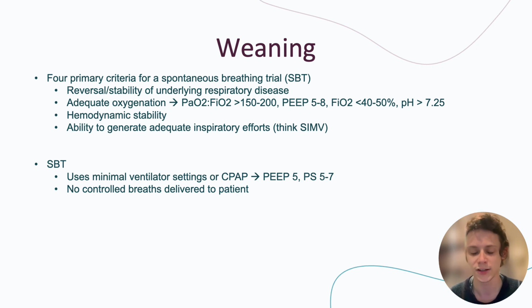Typically, spontaneous breathing trials are done once a day or so, a couple times a day. They can be 30 minutes to a couple hours. Typically, they'll start off at 30 minutes and then move, increasing in time until the patient basically fully passes an SBT and is able to be extubated. So if a patient is able to maintain adequate oxygenation and respiration during this SBT, they are proving that they can likely be extubated. And that is how the ventilator is weaned.